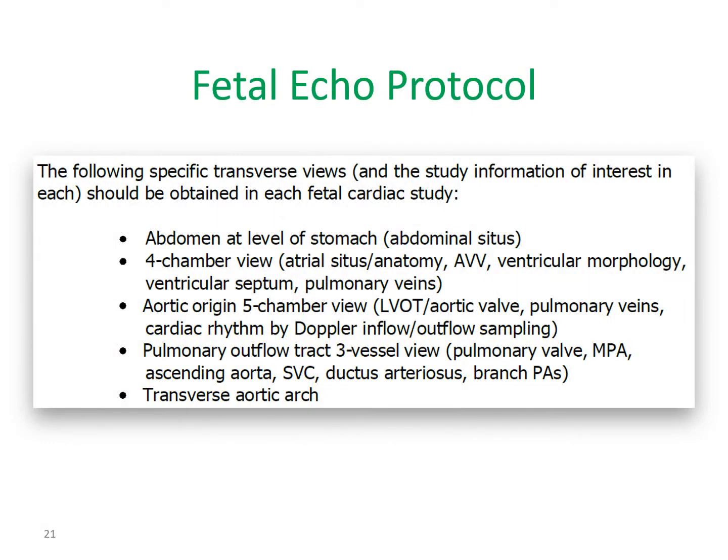So now we start our fetal echo protocol in the transverse views, and specifically we start out in the fetal abdomen. We look at the level of the stomach, we look at the abdominal situs, we then sweep up into the chest, looking at the four-chamber view.